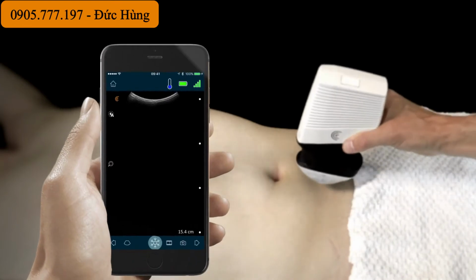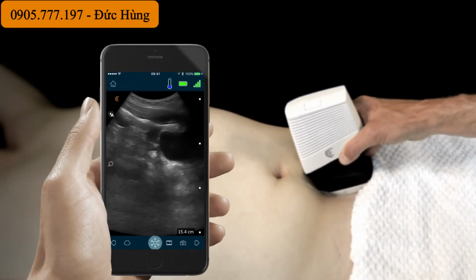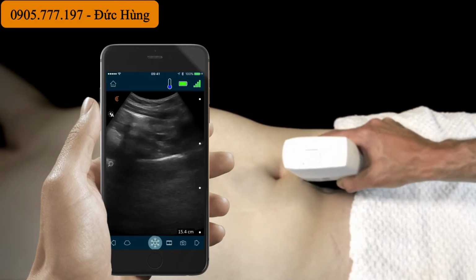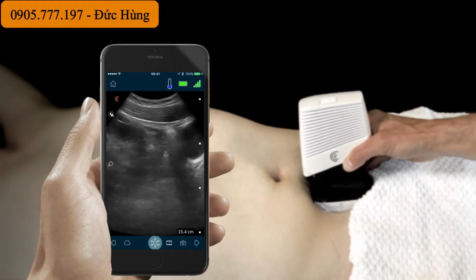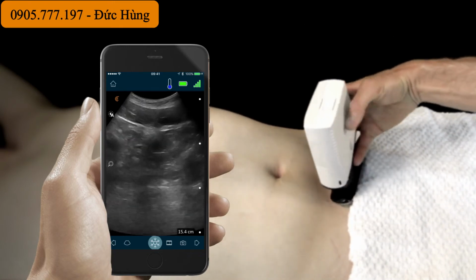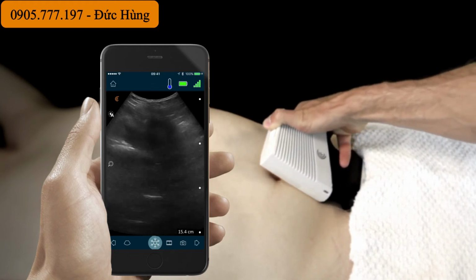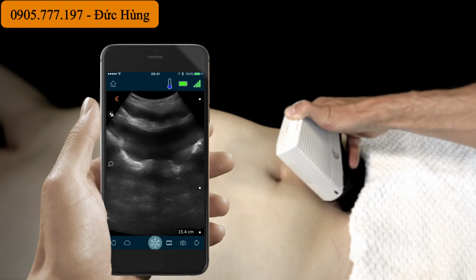For the final phase of the fast examination, we're going to examine the pelvis, looking for any sign of free fluid between the bladder and the rectum. We'll fan in a long axis the patient's left and right to make sure that we don't miss any small, subtle collections of fluid. We'll switch to a short axis, again fanning caudally and rostrally to ensure we don't miss any small collections of fluid.